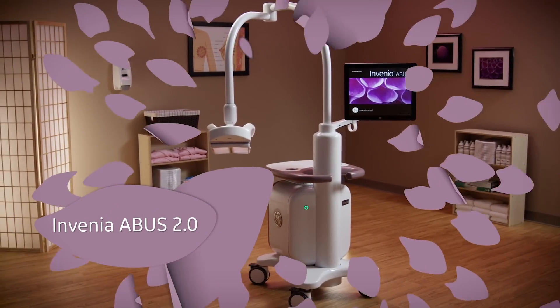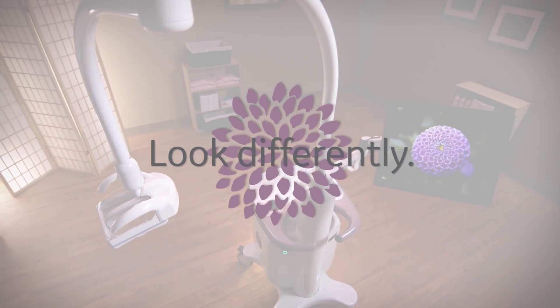Invenia ABUS 2.0 — helping physicians look differently at dense breast tissue.